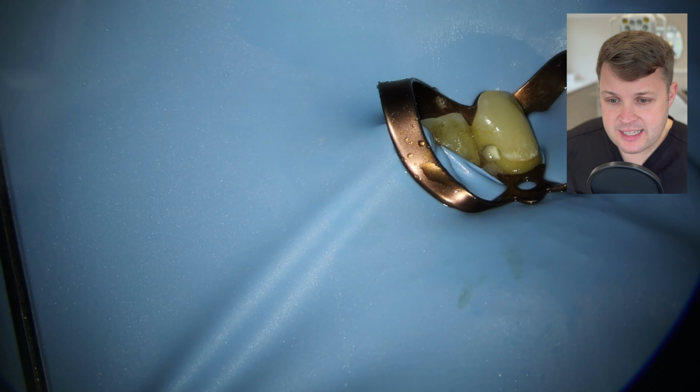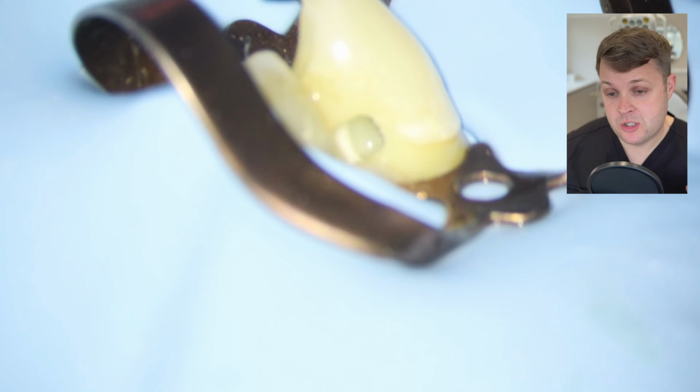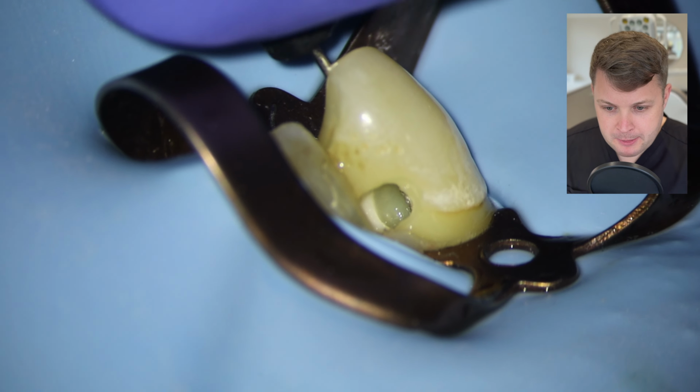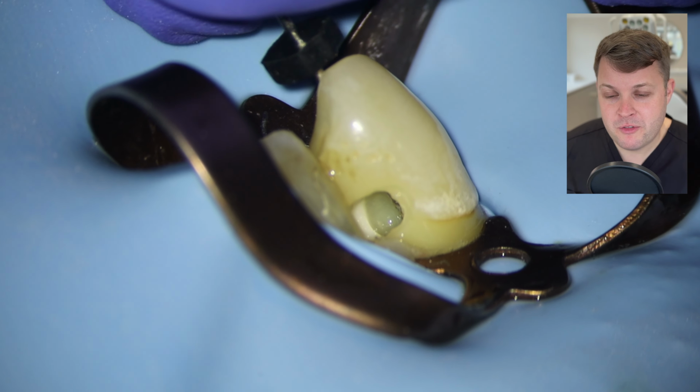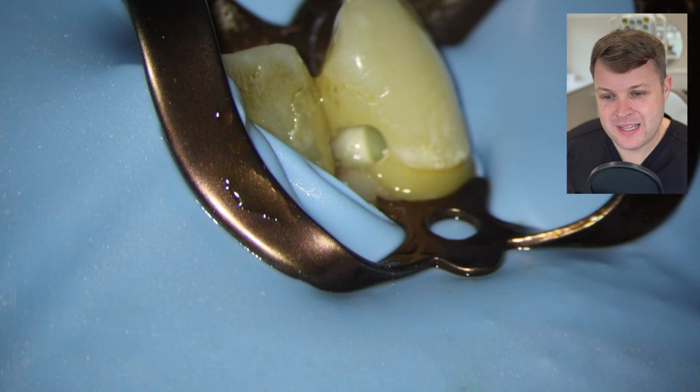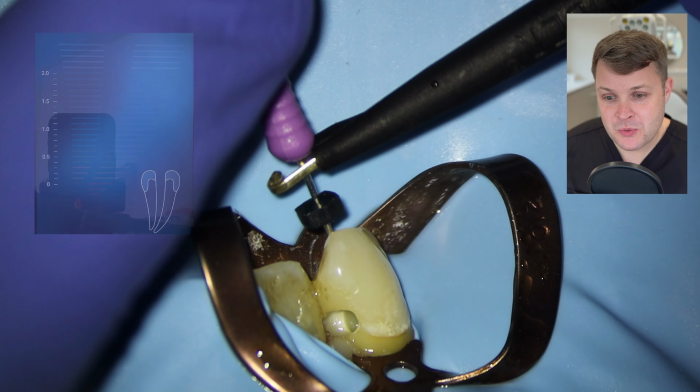And I know that I don't need to open this all up, because I can reach the inside of the pulp chamber and fill it adequately, because the buccal access is adequate enough. And then we can see when we place the hand file through now our conventional access, you can see through the buccal where the hand file is sort of negotiating.